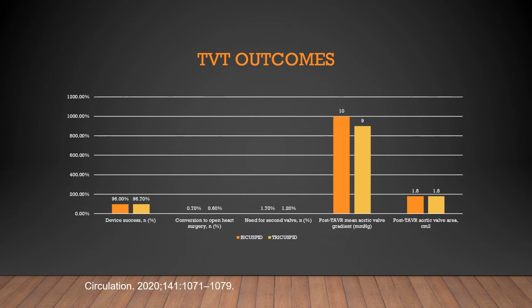The post-TAVR mean gradient was not much different, and certainly not statistically different. And the post-TAVR aortic valve area was also similar. Again, very, very good outcomes in the real world, which is very comforting to know.